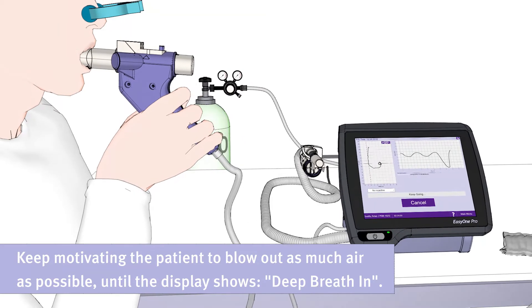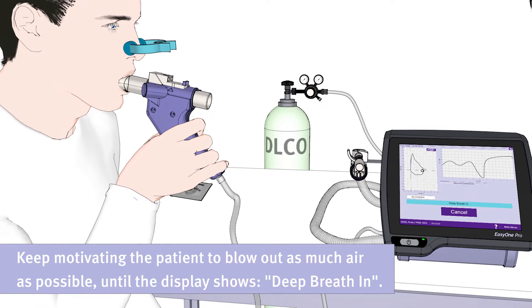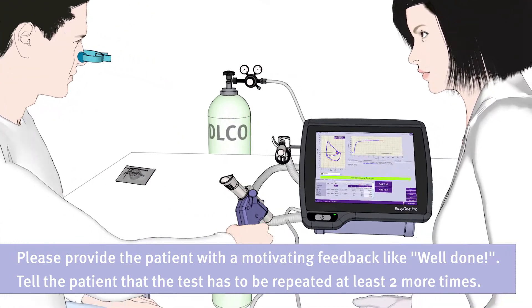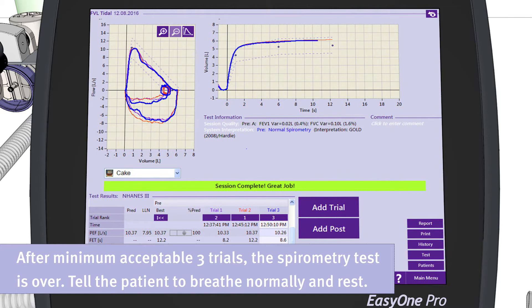Please keep motivating the patient to blow out as much air as possible until the display shows deep breath in. Then, ask the patient to take a deep breath in. Please provide the patient with motivating feedback, like well done, and tell him that the test has to be repeated at least two more times. After a minimum of three acceptable trials, the spirometry test is over, and the patient can be told to breathe normally and rest.